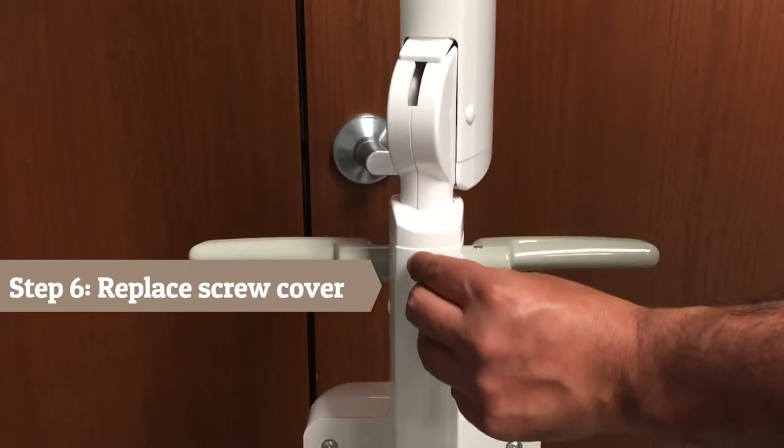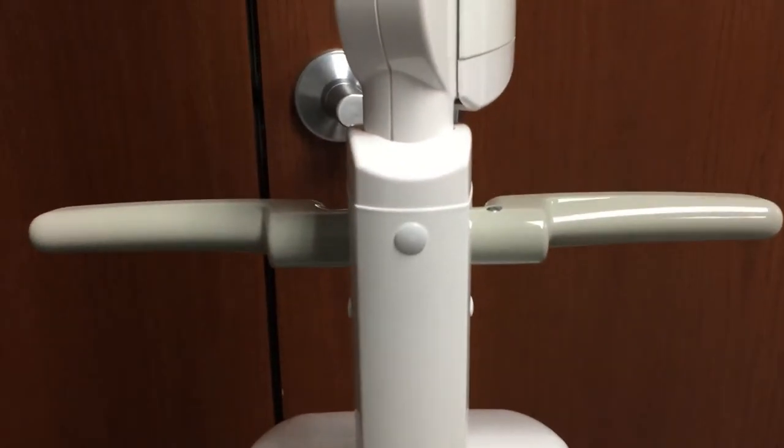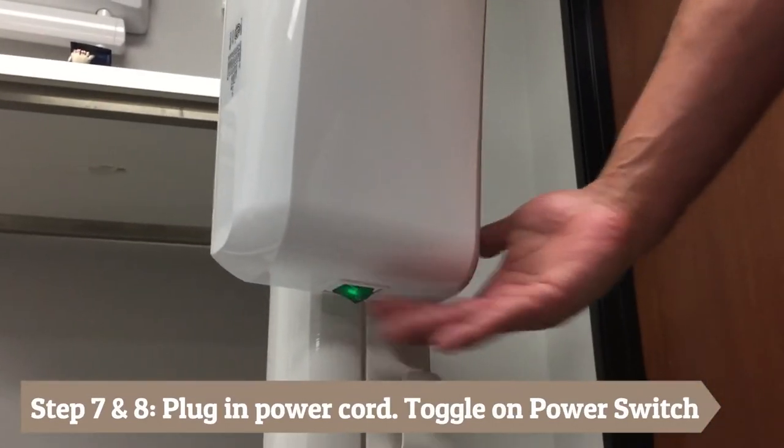Step 6: Once the tension bar is correct, replace the screw cover. Step 7: Plug in the power cable at the wall outlet. Step 8: Turn on the generator.